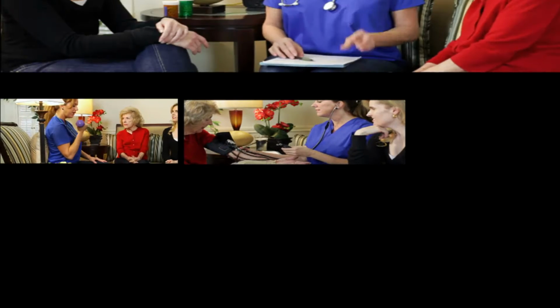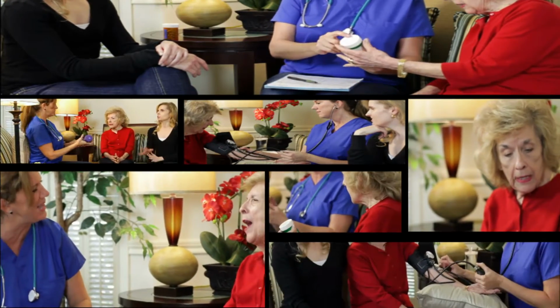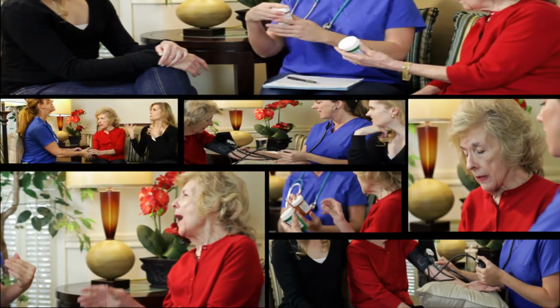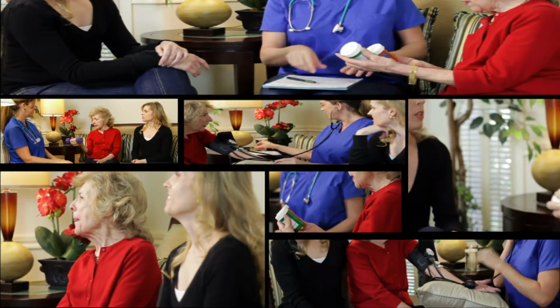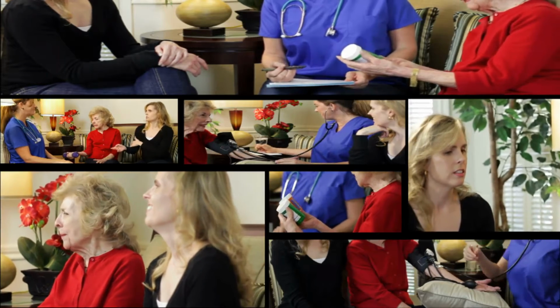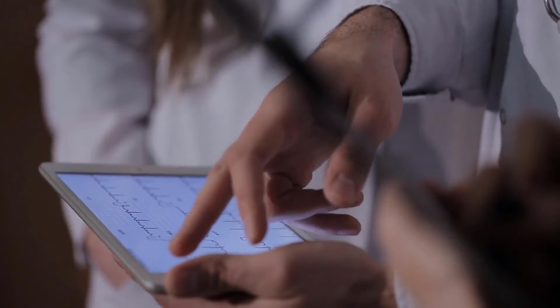What is a FDG positron emission tomography scan? A FDG positron emission tomography scan is a medical imaging procedure. It involves an injection of radioactive tracer liquid inside the body that congregates at tumors and other sites where the cells divide more quickly than usual. The acronym FDG positron emission tomography scan stands for fluorodeoxyglucose, FDG, positron emission tomography, PET, where the FDG is the radioactive liquid and the PET is the scanning machinery.